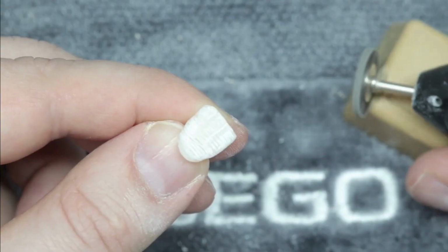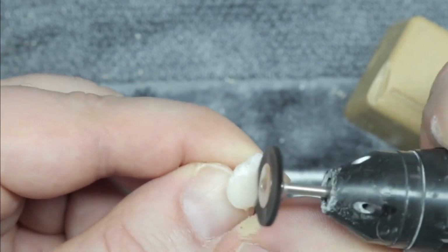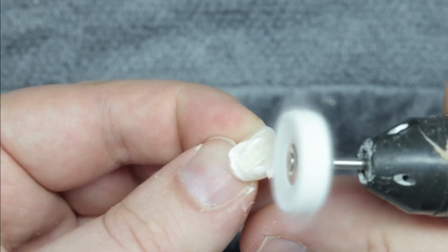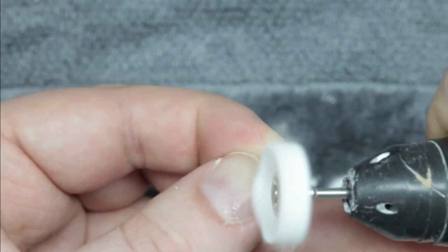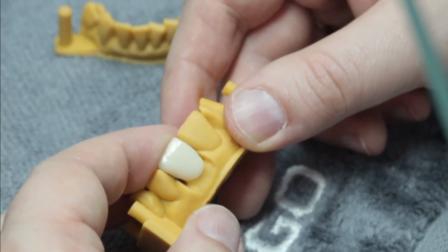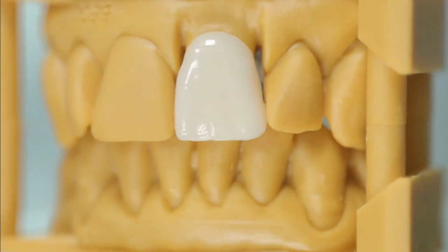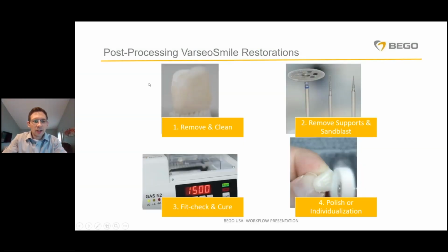And then they're going to finish this unit simply by polishing using conventional blocks. That I believe is a medium grit. And you'll definitely want to work up to a fine grit and get it to that high shine to prevent that plaque and really bring it to its final state. Or like I shared, you can use a stain and glaze kit on it and give it some individualization in that manner. But in the end, it fits the model nicely. Okay, let's go back to the presentation.